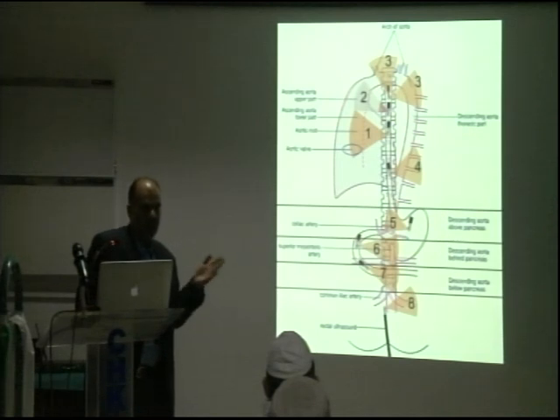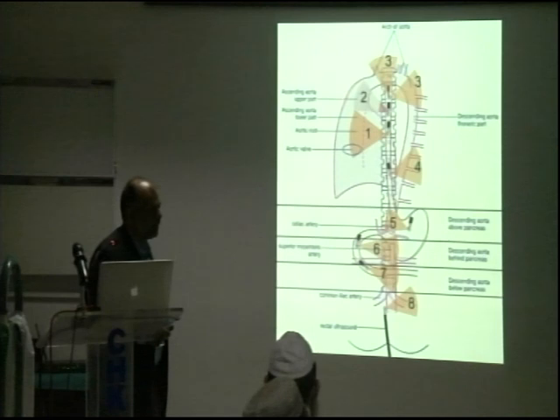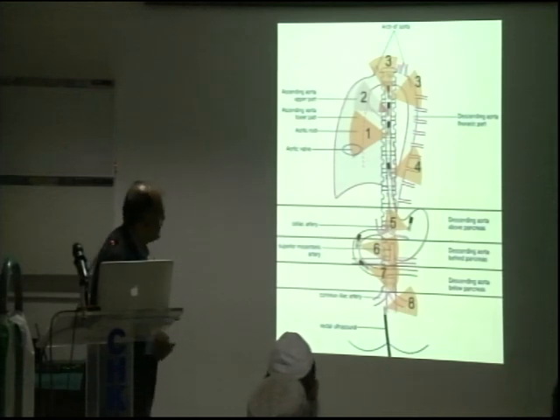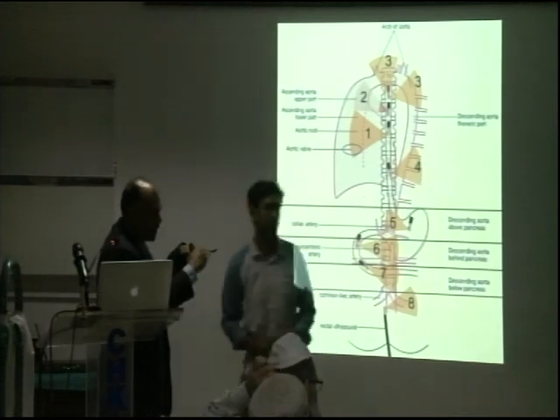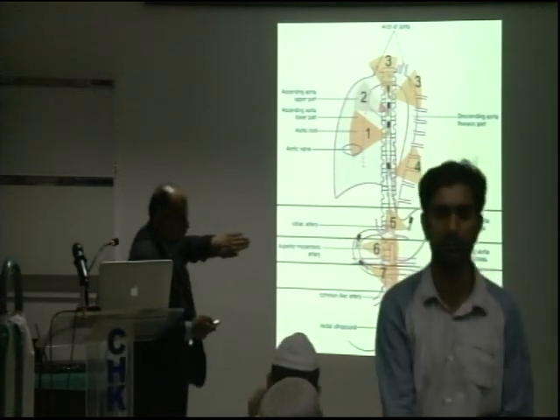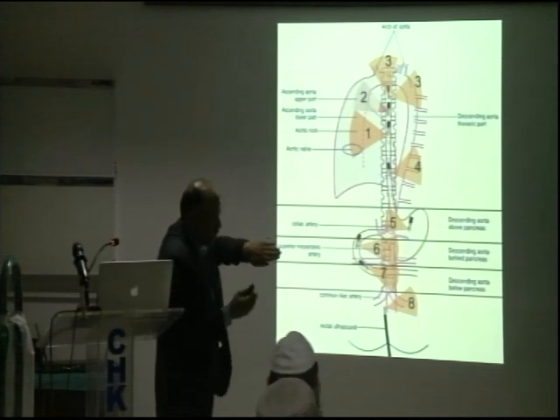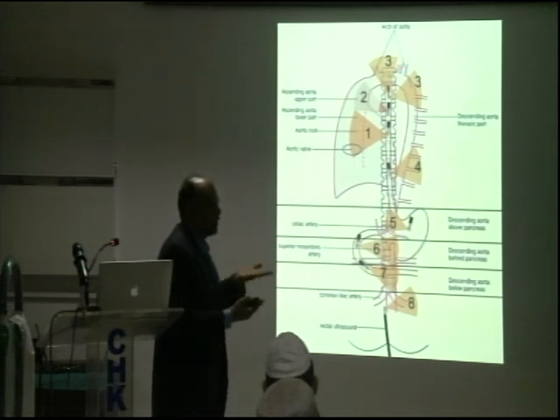what structures you're going to be looking at. Because sometimes, as far as I conceptualize it, once we introduce the scope and we're in the esophagus, the transducer of the scope is actually facing towards the sternum. Yes. Then based upon that, using it as a reference, we can orient ourselves. What I'm saying is, for the rotation purposes, if the patient is lying like this, take the spine as the central part. Because if the scope is facing posteriorly, the rotation when you rotate it would be in the opposite direction to when it is facing anteriorly.